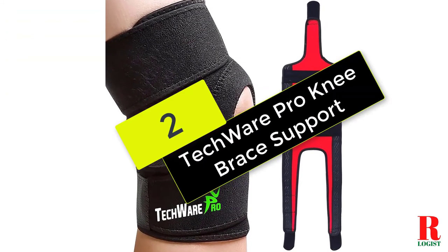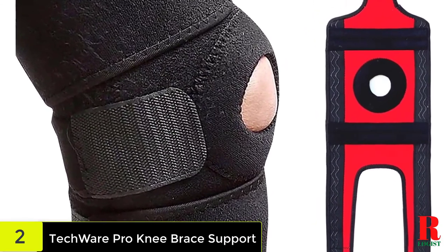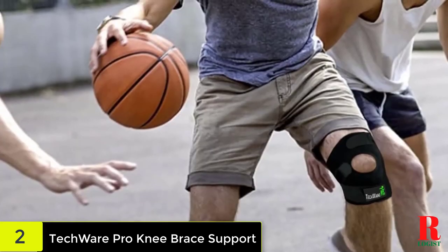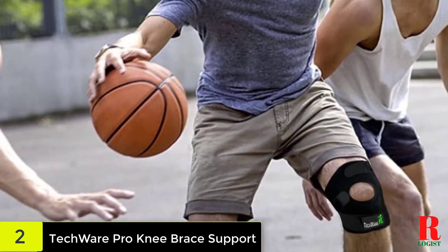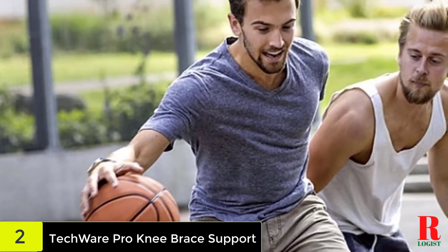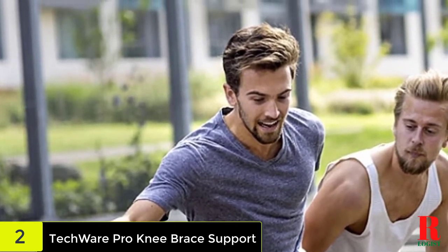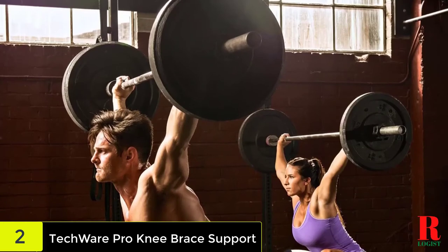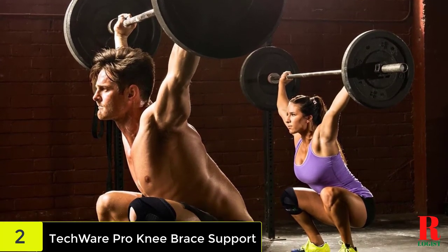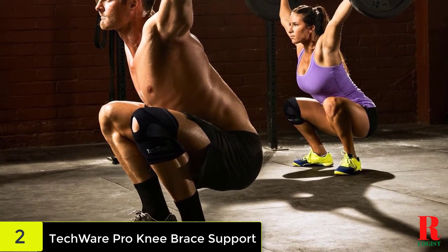At number 2 on our list, we have the Techwear Pro Knee Brace Support. Featuring an open knee design, the Techwear Pro Knee Brace Support is a great brace for those with hyperextension injuries. It provides maximum compression and support on the knee, while also supporting the surrounding areas and tendon. This knee brace features adjustable bi-directional support for maximum compression. Made from breathable neoprene material with moisture-wicking abilities, this knee brace is comfortable enough to wear while providing the support your joints need to heal from injury.